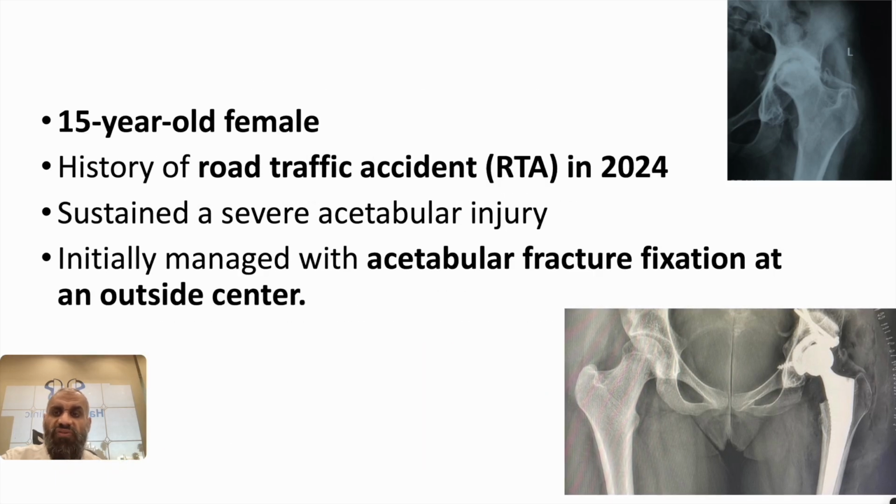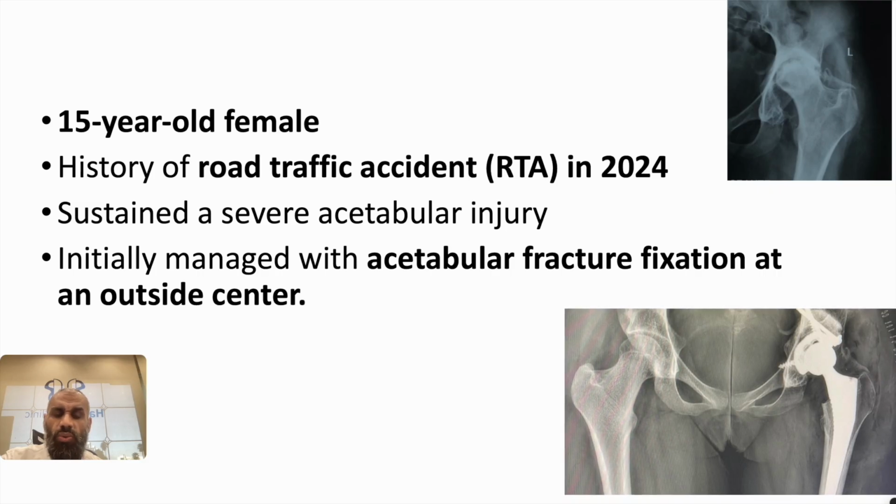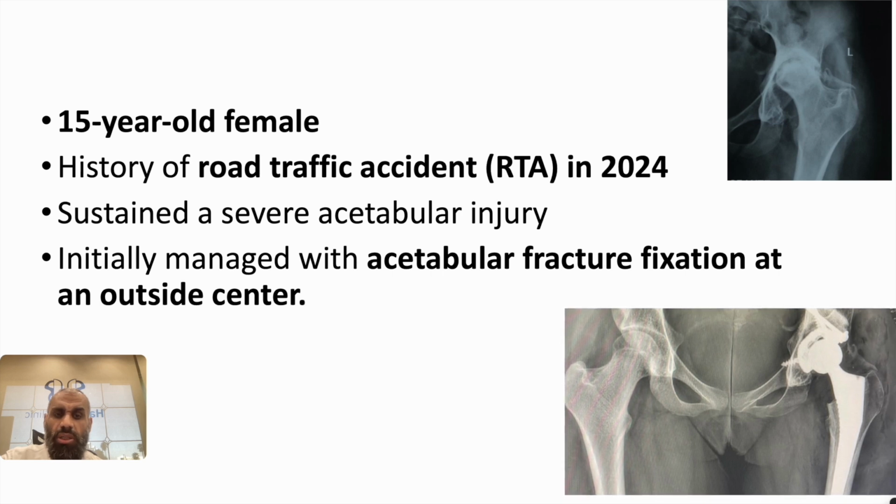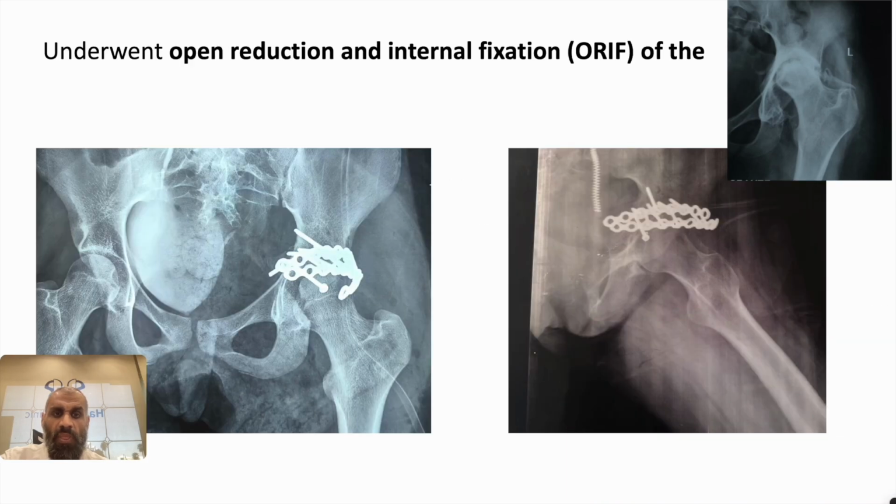We received a 15-year-old female with a history of RTA in 2024. She sustained a severe acetabular injury, a posterior fracture dislocation, and was initially managed by inadequate open reduction internal fixation at another center. This was the post-operative X-ray.